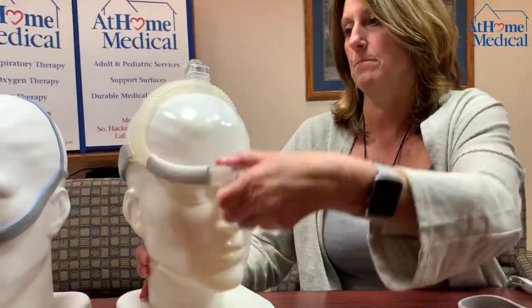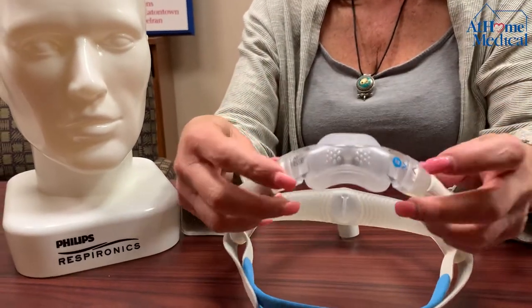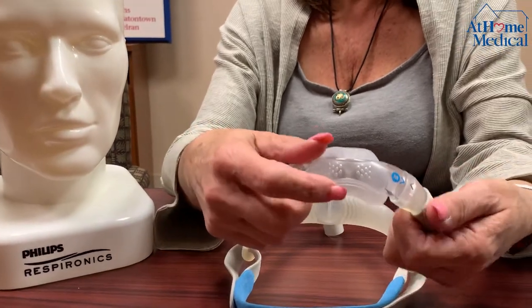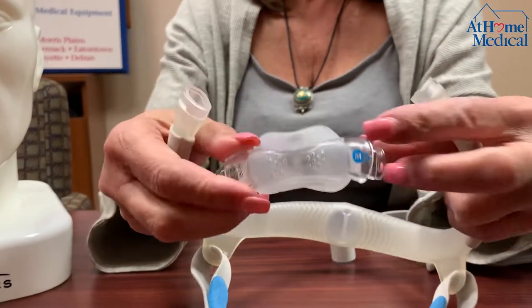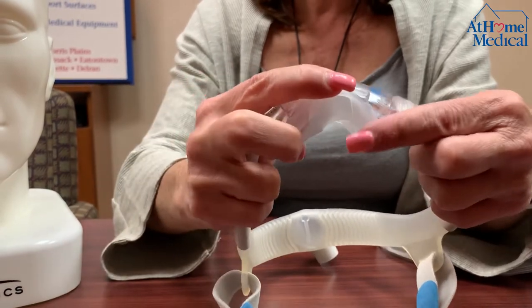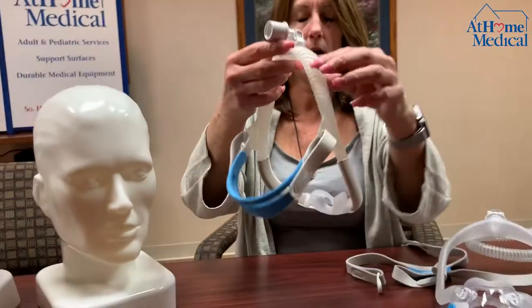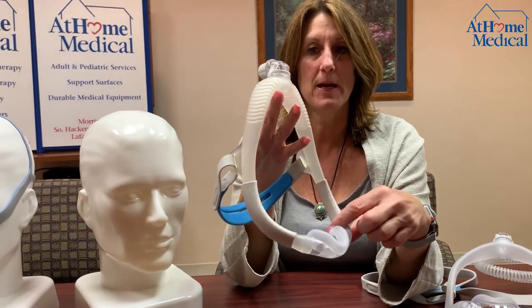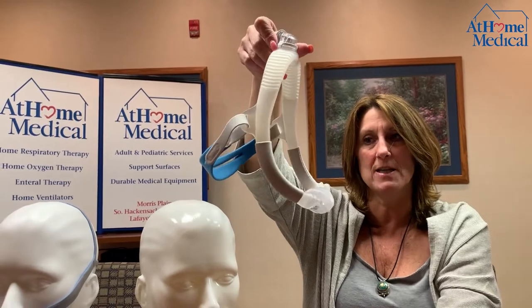This one is just a nasal mask that goes under your nose. Notice that there are two arrows on the side — that shows you how to take the mask apart and you can put it back together the same way. You want to wash this every day in soap and water also. Take soap and water and run it through the headgear of the mask. I always say hang it over a shower bar so all the water drip-dries out of it.